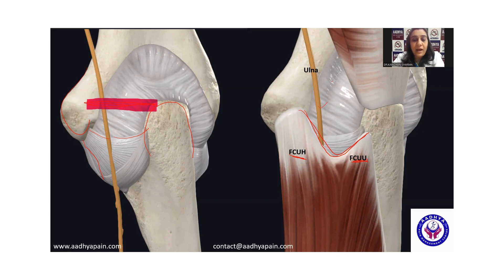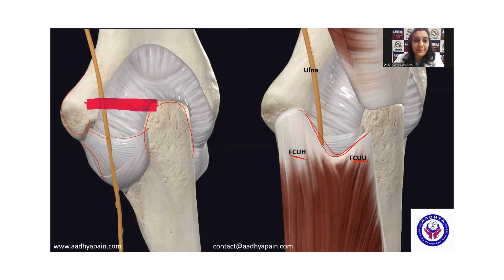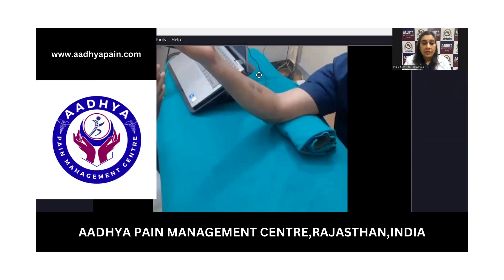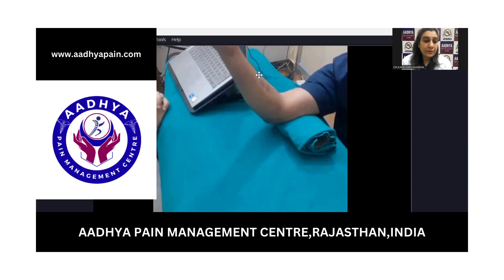Let us see how exactly the ulnar nerve looks inside the cubital tunnel and how ultrasound can help us in the dynamic examination of this ulnar nerve. So let us now see the ulnar nerve in the cubital tunnel.